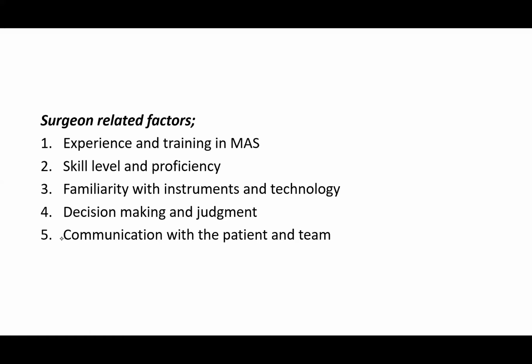Now, decision making and judgment, because during the procedure you might be in a dilemma where your decision will determine the outcome. You might want to proceed, you might want to convert in case of difficulty like injury, bleeding, and bizarre and distorted anatomy where you cannot proceed.